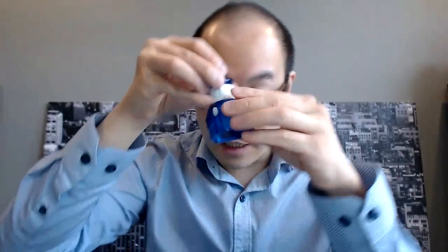Okay, so to put this on, this is the inserter device. It's just like so, and then like so. It's very similar to the Libre device, actually. Just like so, and then like so, okay? And so what you do is, I'm inserting it here like so. Let me get this.